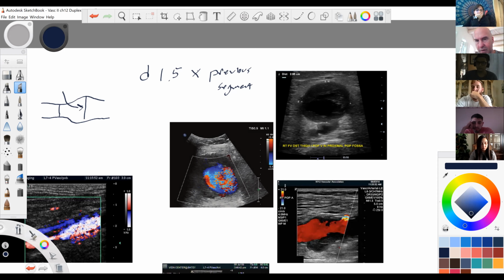Right distal thigh pop. So high in the popliteal, low in the distal femoral. They're not 100% sure. They have a nice aneurysm here. I don't know if you could see. I'm going to kind of draw in a residual. God, I can barely see it myself.